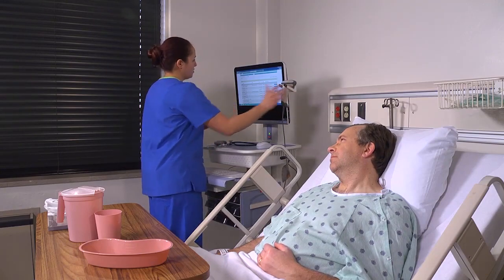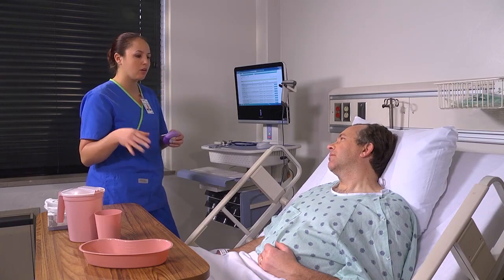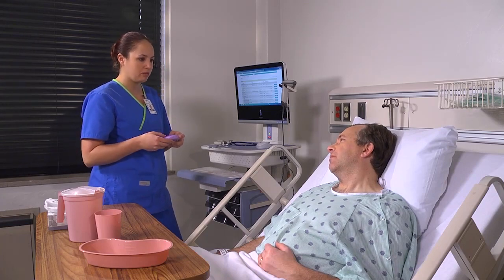The inhaler is a handheld device that delivers a measured dose of medication to the airways. A dry powder inhaler, or DPI, delivers this medication as a fine powder rather than an aerosol or mist.